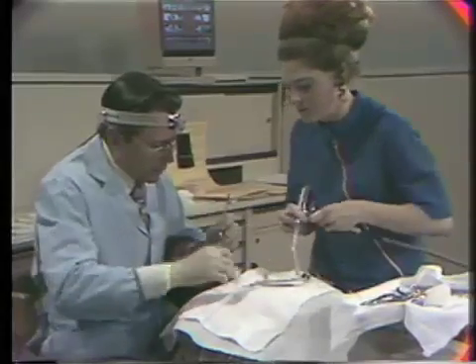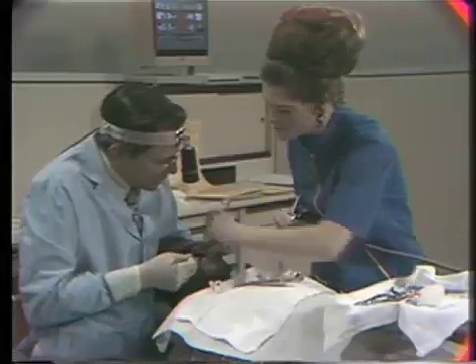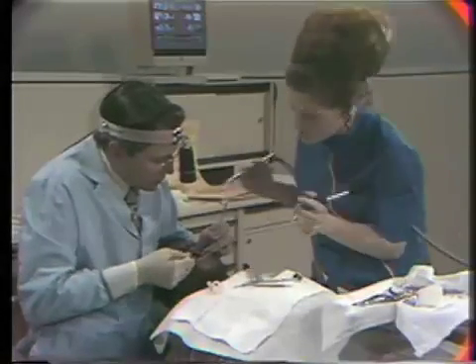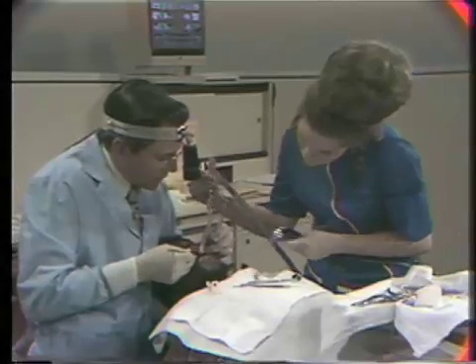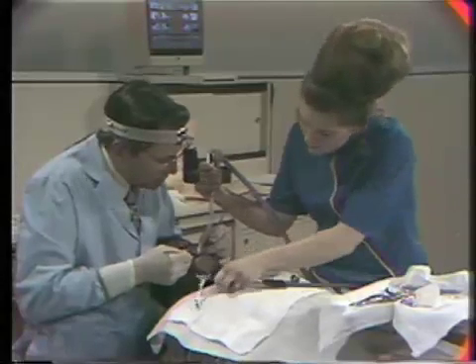This is what's nice about a videotape, is you get to see everything, and we all have problems at times just like anybody else. And if things don't go quite right, you merely keep on operating, keep on going, because you can correct it and straighten it out, and there's no problem with the patient other than he got a little red stuff on his chin.